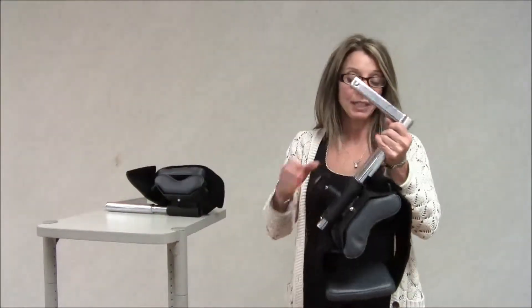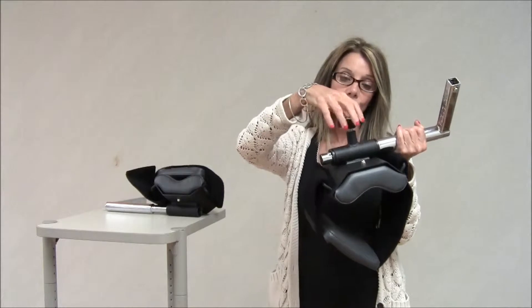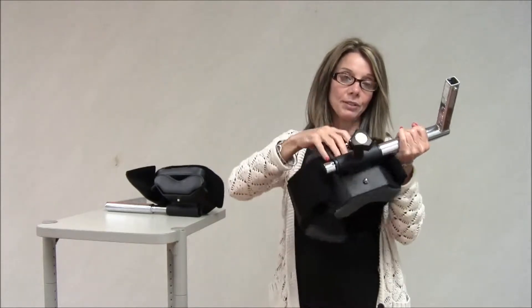This is the pediatric attachment. One of the largest features that's most apparent is this knob here. It swivels. You can tighten it up so that the pads do not swivel, or you can loosen it so that the pad does swivel.